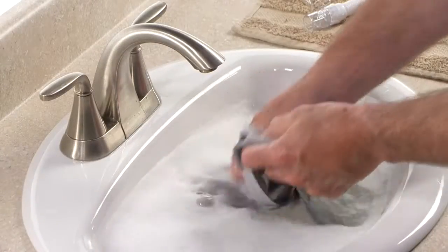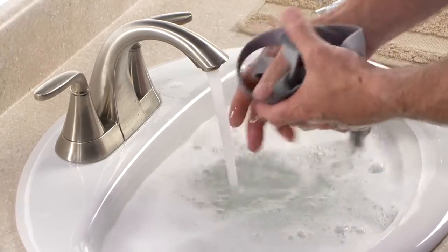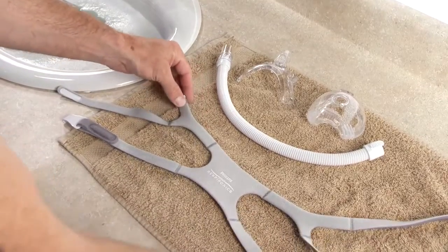The headgear should be washed weekly or as needed. Unlike this demonstration, it does not need to be removed for daily cleaning. Lay wet headgear flat or line dry. Do not place the headgear in the dryer.